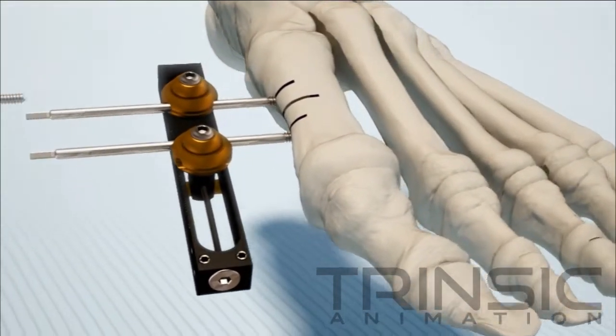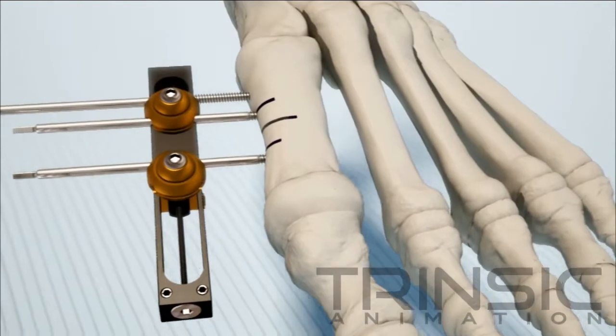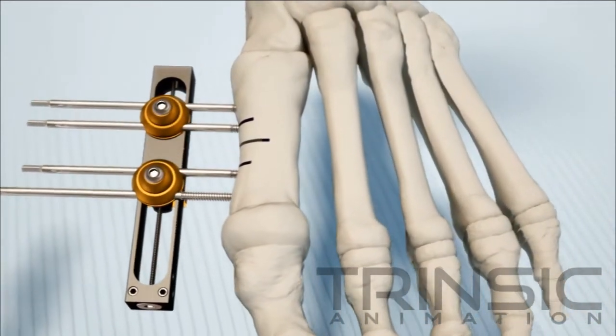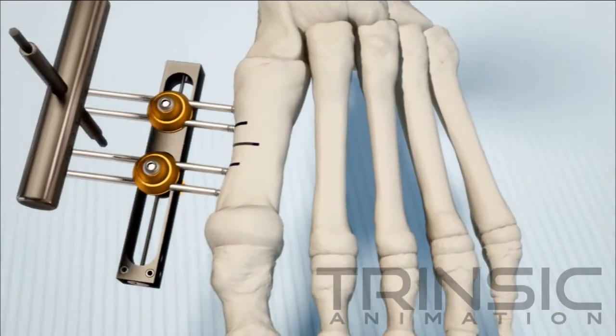Introduce the remaining two half-pins using the rail itself as a template, adjusting the clamp openings as necessary. Avoid excessive loosening of the clamps.